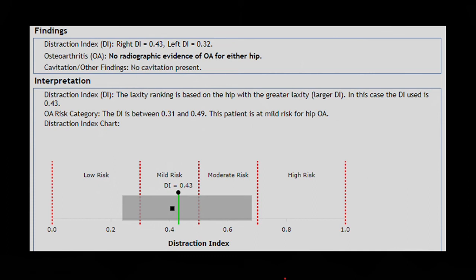Interpreting these reports can always be a little bit complicated, depending on your particular case, and that's something that we'll certainly talk about when we get that report: how do we apply this to your dog, whether they're clinical for hip issues, or if this is part of a breeding program, how do we apply this dog for improving the hip conformation in the kennel, anything along those lines. That's something that we'll certainly talk about pending the report from PennHip.